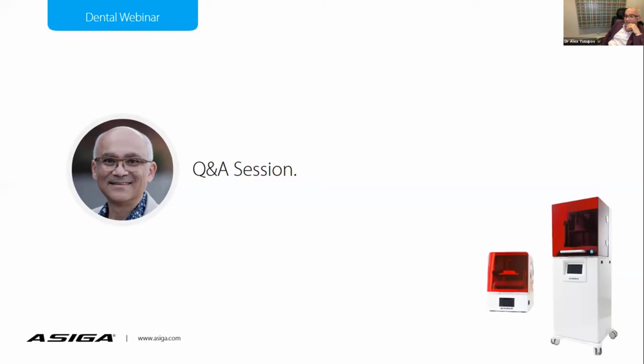I use Netfabb a lot for fabricating other things. So, for example, to add a virtual screw to the model, I have to take it out of the 3Shape environment, because it won't let me do that. So I do it in Netfabb, and then I reintroduce the model with the virtual screw or cradle or TAD back into 3Shape appliance designer, and design an appliance around it.